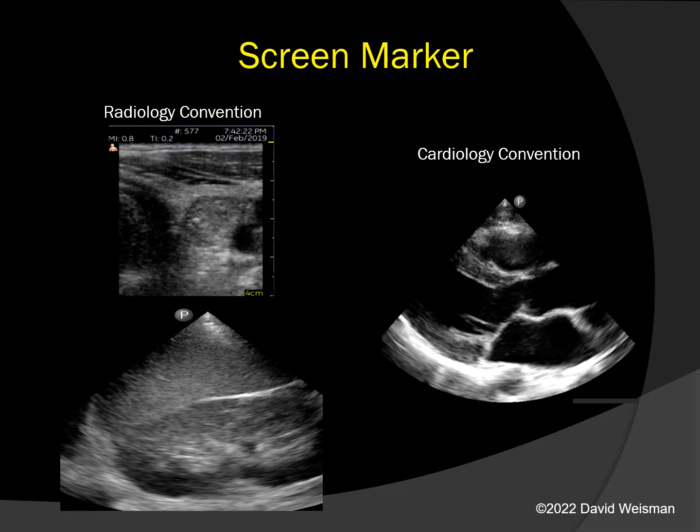And everything kind of gets blown up in echocardiography world. In echo world, because our friendly cardiologists created echocardiography, they chose to place the computer marker on the right side of the screen. So everything in echo world, for the most part, typically done throughout the world, will be on the right side of the screen. We'll talk more about orientation in echocardiography in our next session.